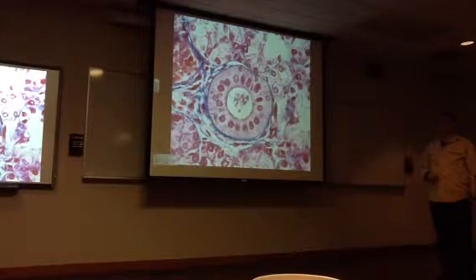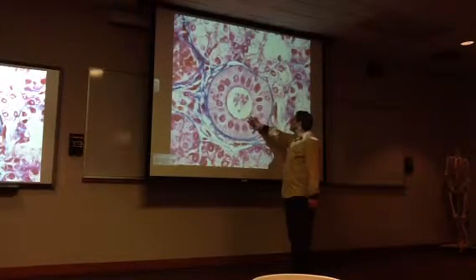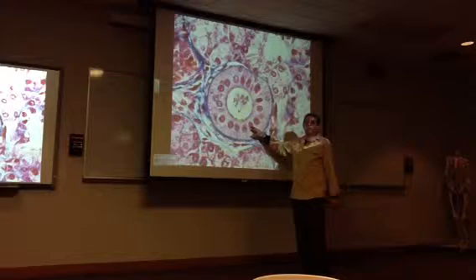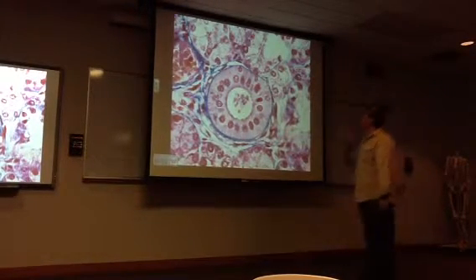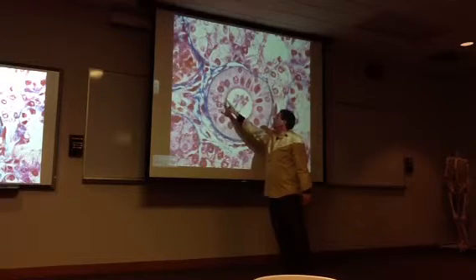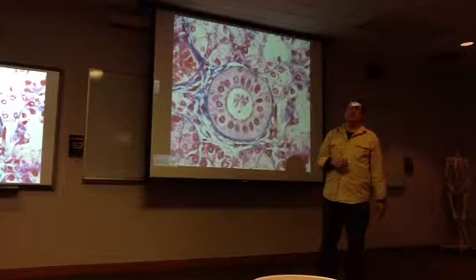I was thinking that was going to be simple cuboidal just by the shape of the nuclei. Oh, we didn't ask to identify this one, did we? Yes, you did. Okay. What did we call it? Simple, I think, columnar, you called it. Simple columnar, okay, because it's a large duct, all right? However, I would accept that. If you called it simple cuboidal because you're seeing nuclei like that, I can't argue with you, okay? And I would probably accept that as an answer.